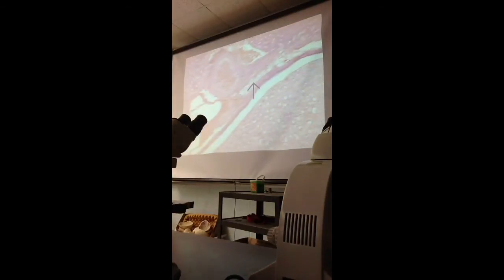Here you are able to see some corpuscles, renal corpuscles. This one. So this is all renal cortex. When I go more towards the center, here you can see all the longitudinal sections taken through the tubules. So medullary pyramids, and all these will come close and end into this space, roughly this space, the minor calyces, major, and then.